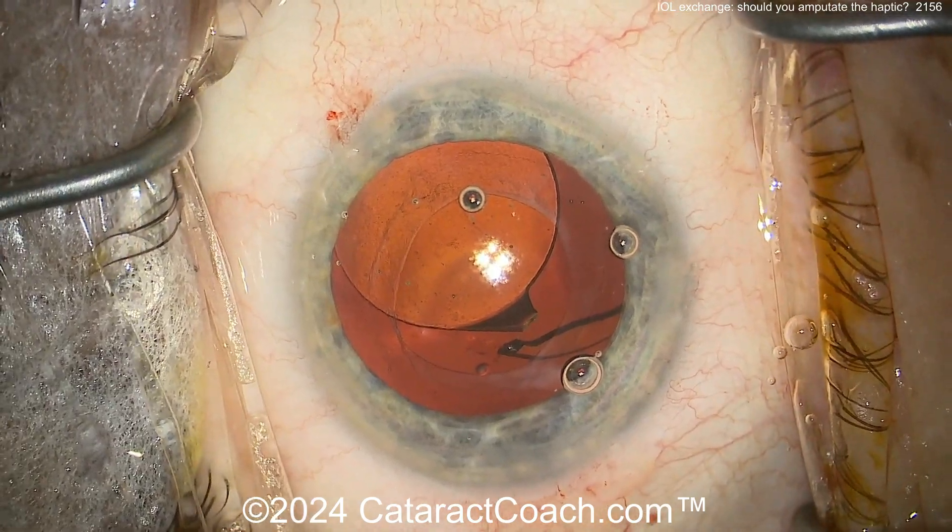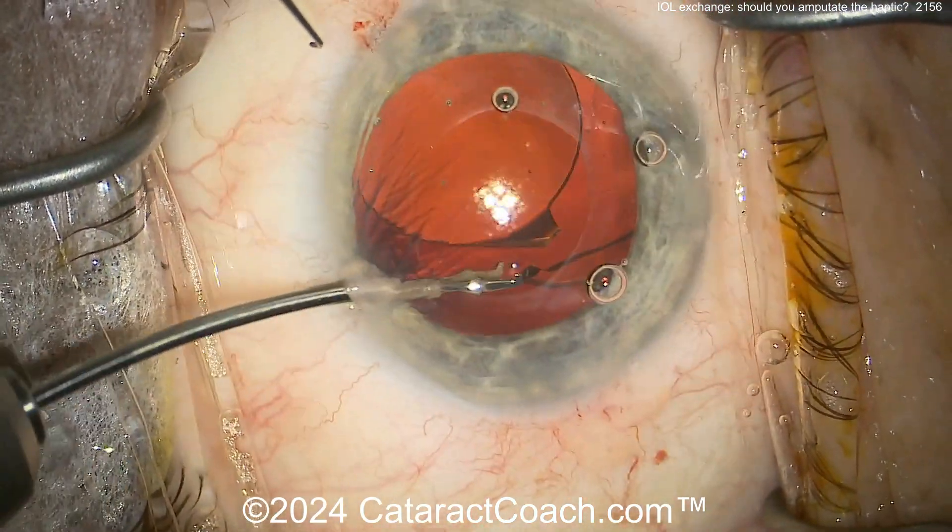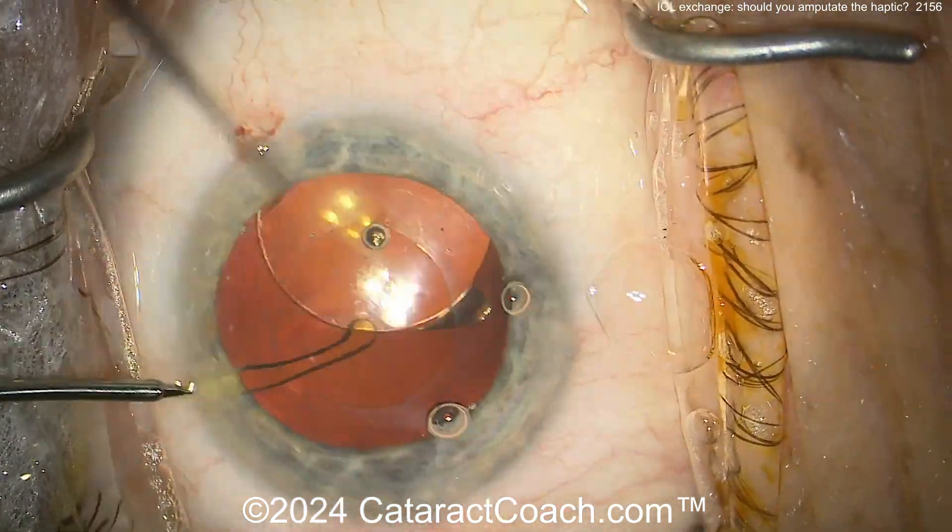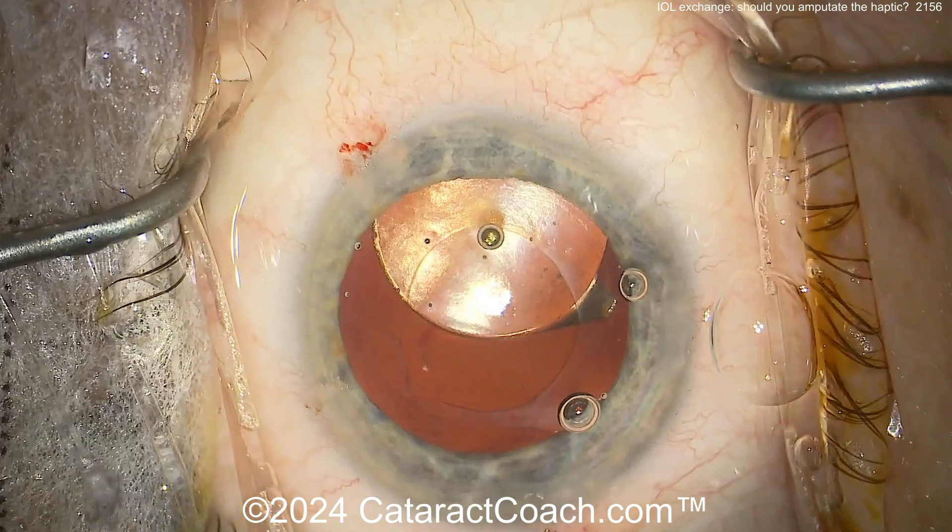So there's one haptic now cut. You can cut it at the haptic-optic junction, but sometimes it's more helpful to cut it a little further. And now it's been removed.